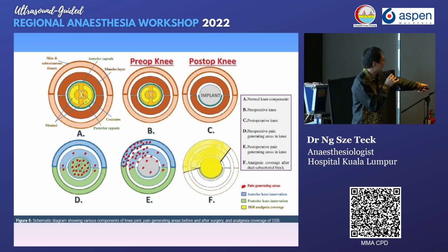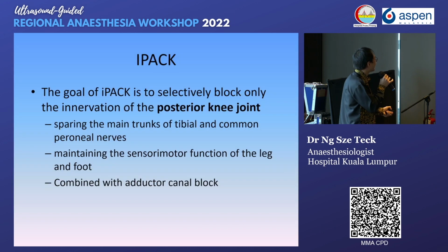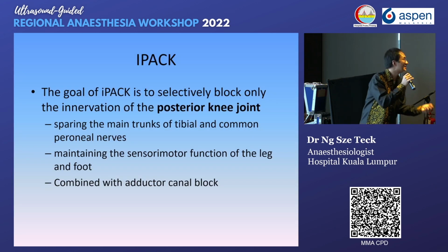We're still missing the posterior capsule. So if your patient has posterior knee pain, what happened? How? There comes the IPACK.